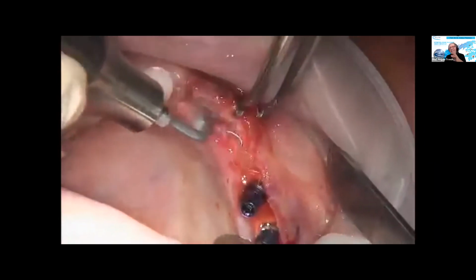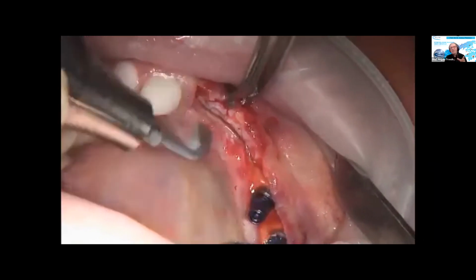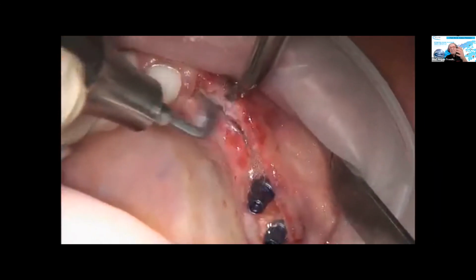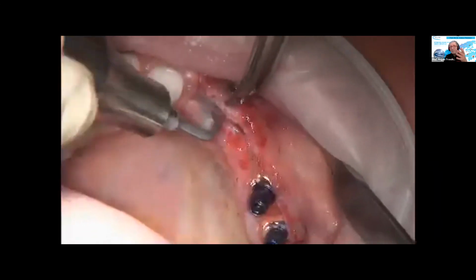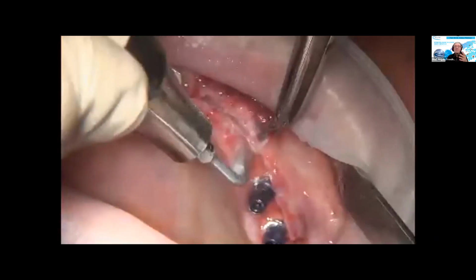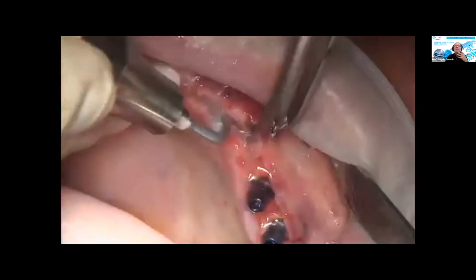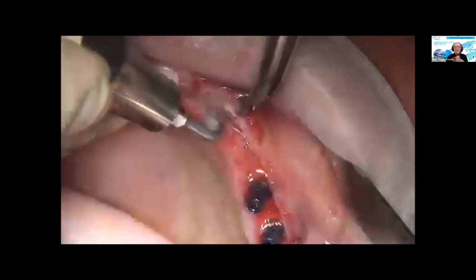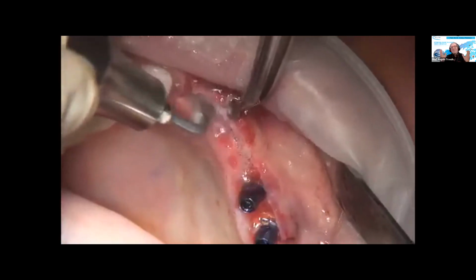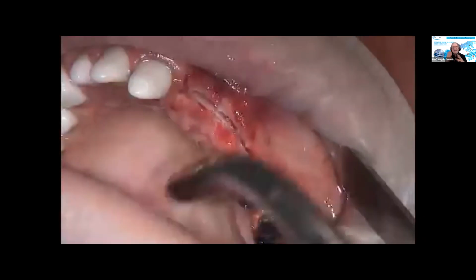But if some part of the bone plate is disconnected from the periosteum, we are in the same situation as with autologous bone block transfer, because the bone is not vital anymore. So the buccal relief osteotomies are a must, and you cannot avoid them to be 100% on the safe side. But it's just 4 minutes in the mandible and maybe 2 minutes in the maxilla.